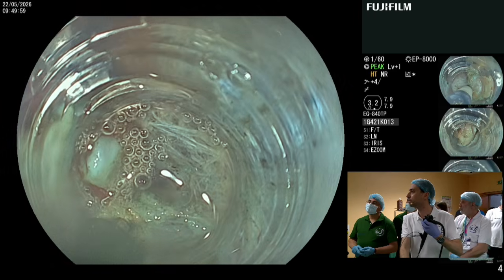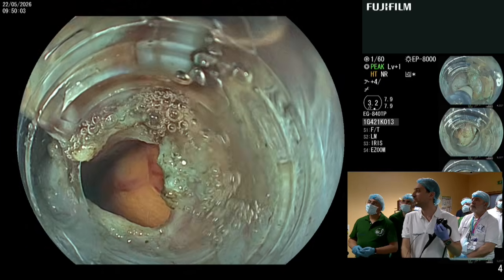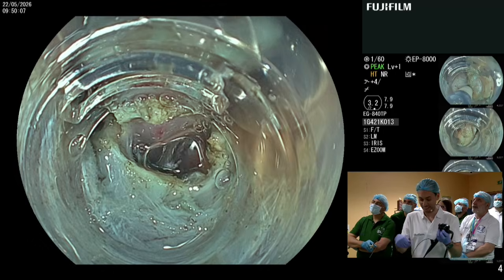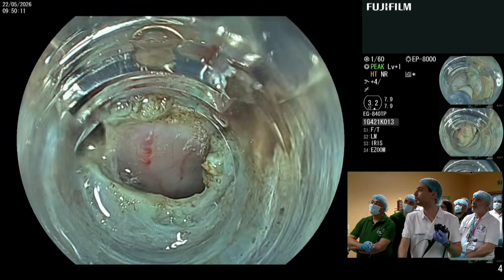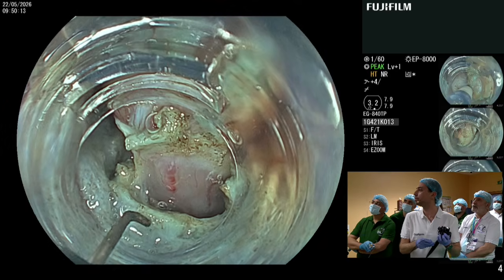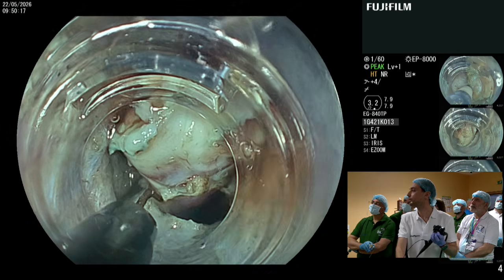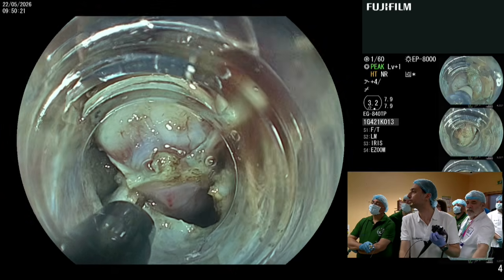Georgios, I understood that there are some questions from the room. Can you ask them? At this moment, it's a critical point. Give me a few seconds, because here we have some big vessels. We have to be very fast and precise.